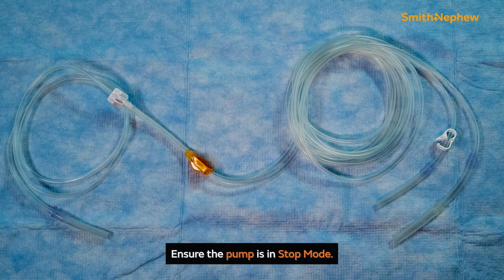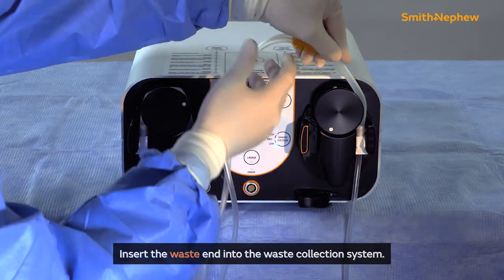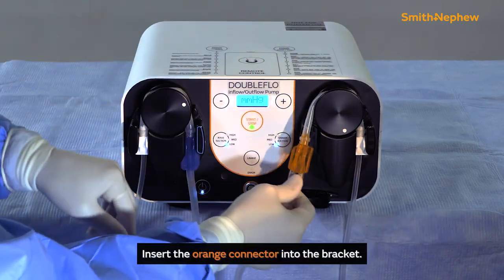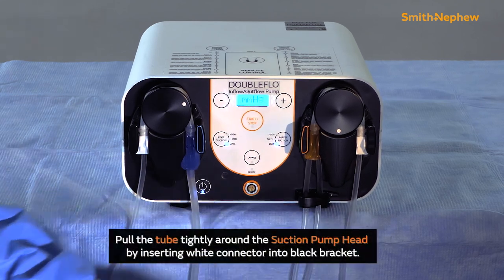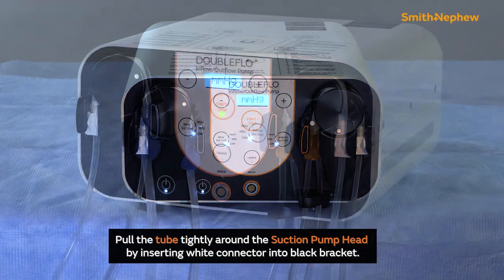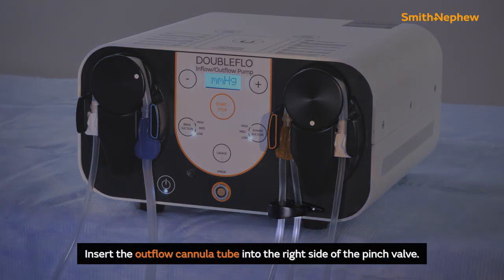To install the outflow tube set, ensure that the pump is in stop mode. Insert the waste end into the waste collection system. Insert the orange connector into the bracket with the orange indicator of the suction side. Place and center the tube around the suction pump head, pulling the tube tight through the right opening of the black connector for the suction side. Insert the white connector into the black bracket of the suction side.